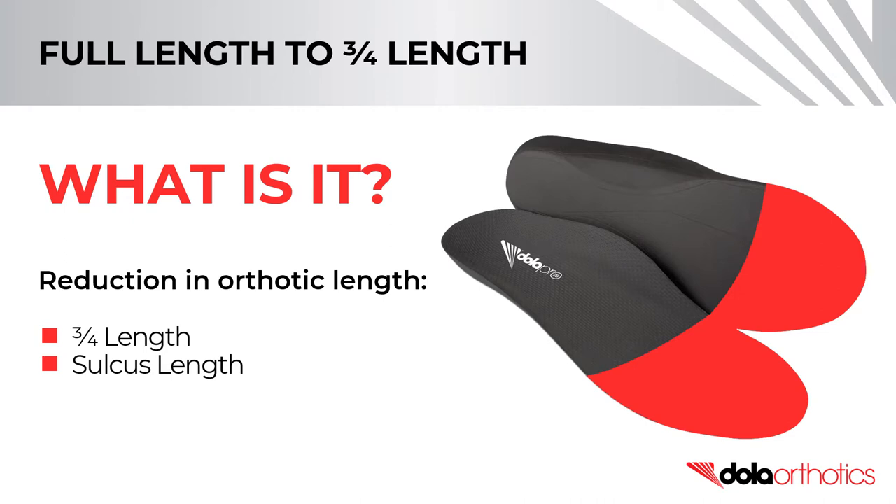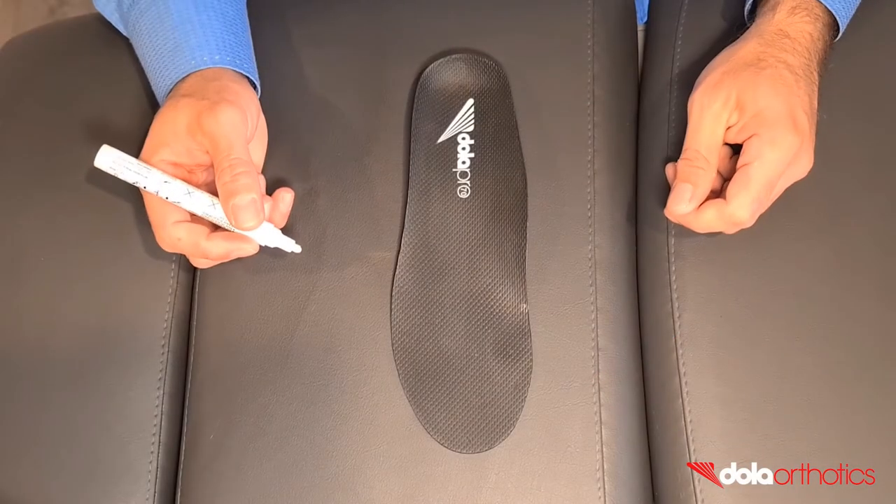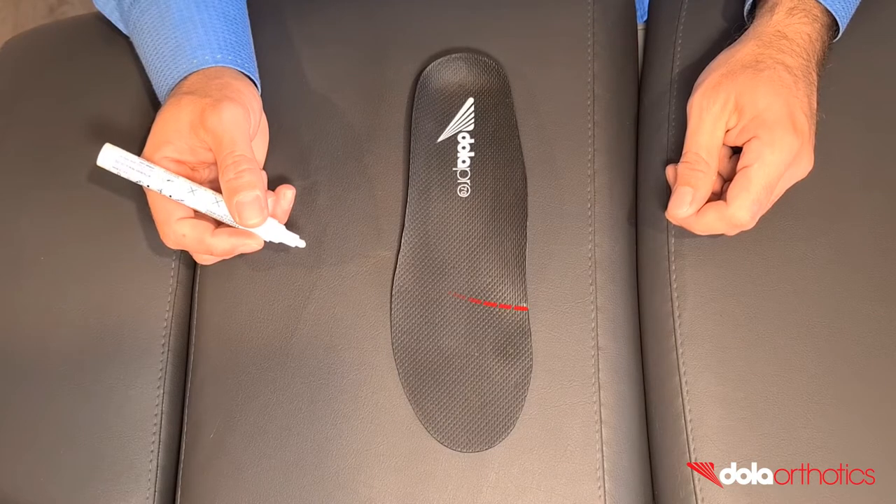Common length reductions include three-quarter length or sulcus length. In this video, we will show you how to complete a three-quarter length modification on a full-length orthotic.